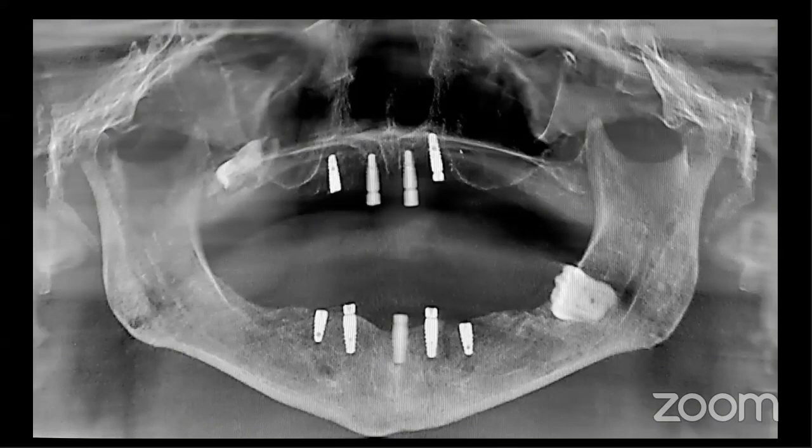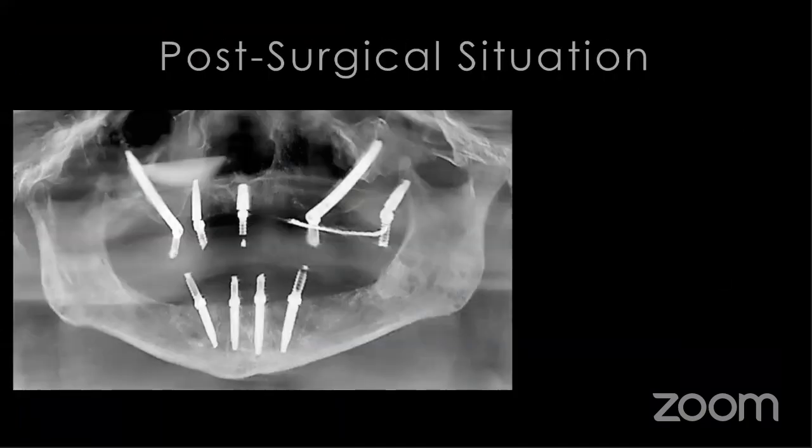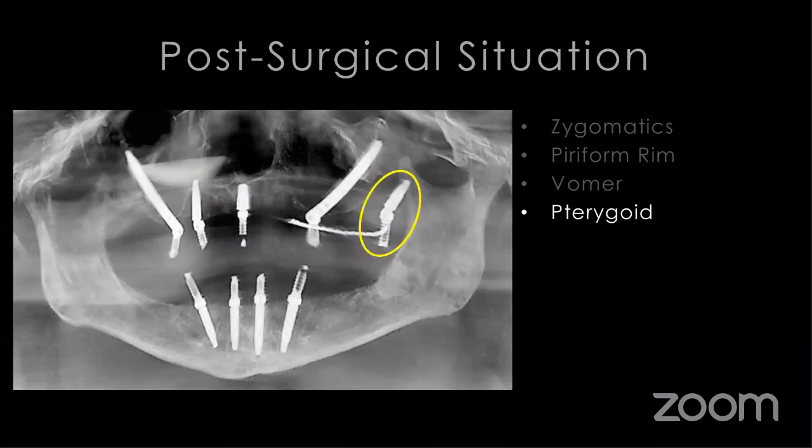As you can see, this patient does not have any restoration because they were not able to immediately load these. He just had dentures. And I can tell you that he was never able to wear the dentures. They just did not fit very well. You can see that there's an impacted mandibular third molar left. There's also a piece of impacted maxillary third molar that was left up in the sinus. And so we ended up taking this case and changing it from this to this. We placed a couple of zygomatic implants. We placed a piriform rim implant, a vomer implant, and a pterygoid implant.